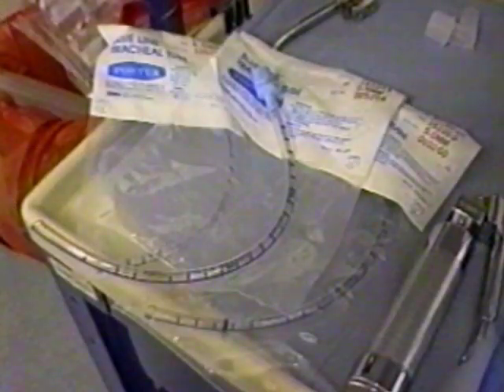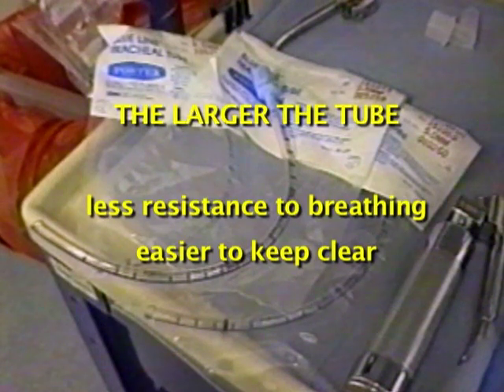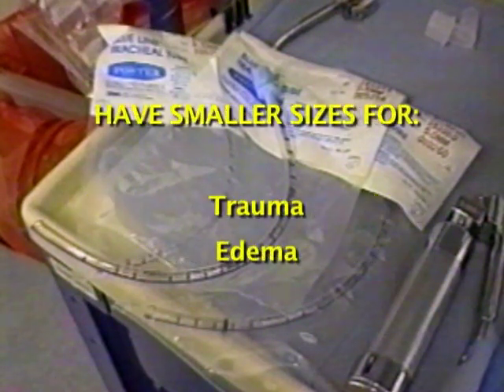Have at least 3 endotracheal tubes immediately available: the predicted size, 1 size larger, and 1 size smaller. You lose valuable time looking for a different tube if you have difficulties. The larger the tube you insert, the less resistance to breathing and the easier it is to keep free of secretions. Have smaller sizes immediately available, especially in the presence of trauma or swelling.